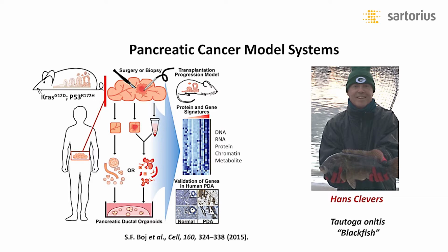They're dependent upon the presence of a mitogen cocktail, as well as Wnt pathway activation and TGF-beta pathway inhibition in a semi-solid media. The most common media that has been used is an off-the-shelf product called Matrigel that you've all heard of. There are lots of alternatives. There are inexpensive ones like collagen, rat tail collagen type 1, and then there's lots of investigational products that are being used too.